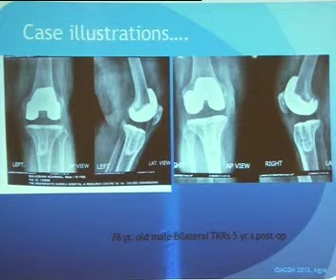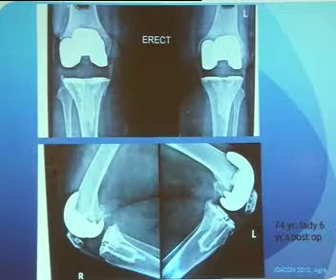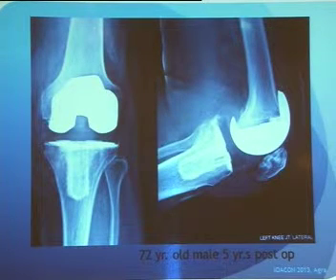Some cases, a 78-year-old gentleman, bilateral total knees done, 5 years post-op. Another lady, 6 years post-op. These were done simultaneous. 72-year-old gentleman, 5 years post-op.